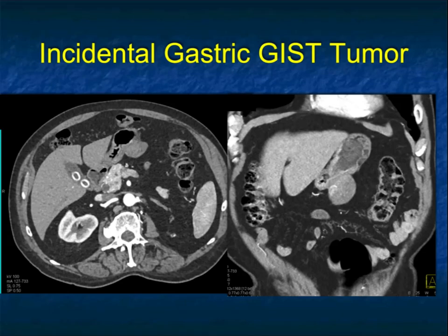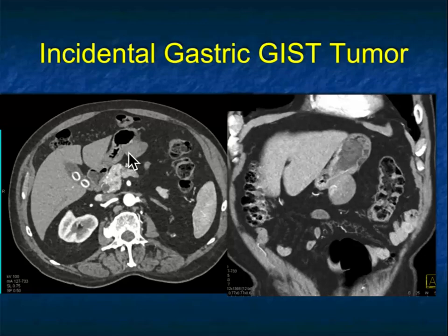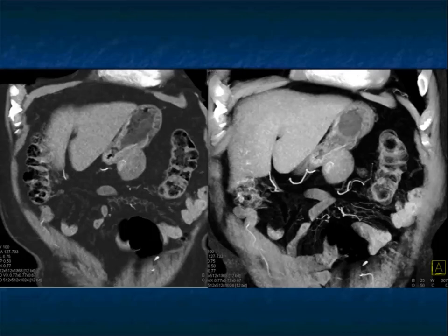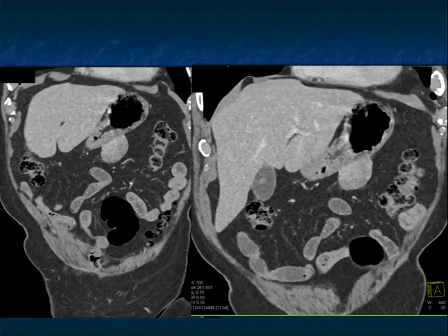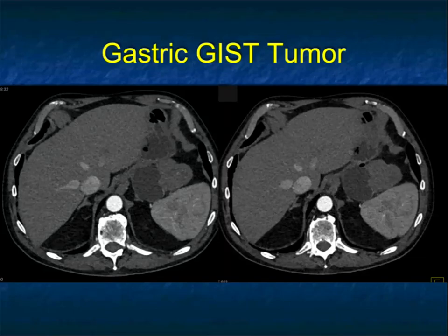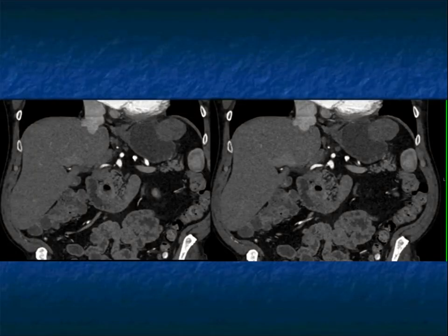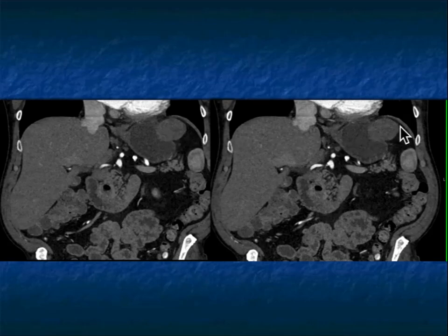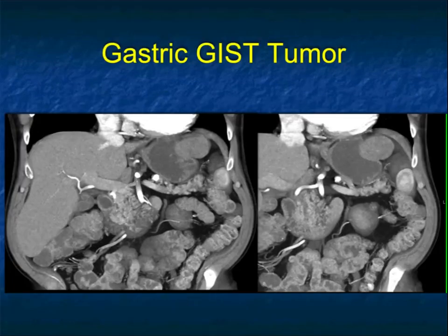Here's another one similar to the last but larger — an exophytic lesion under five centimeters with a faint calcification and mild vascularity, coming off the greater curvature. You can see some vascularity compared to the liver. Another fairly homogeneous, not very vascular GIST tumor in the five-centimeter range, exophytic, seen particularly nicely on the coronal views. I find coronal and sagittal views and 3D very helpful in recognizing these tumors.